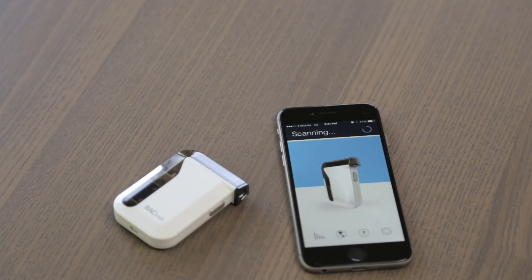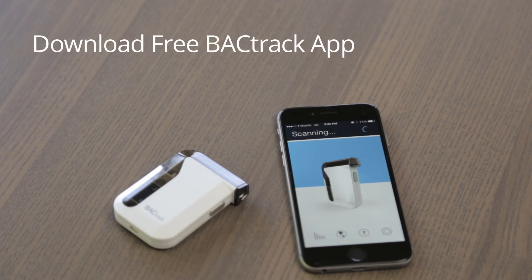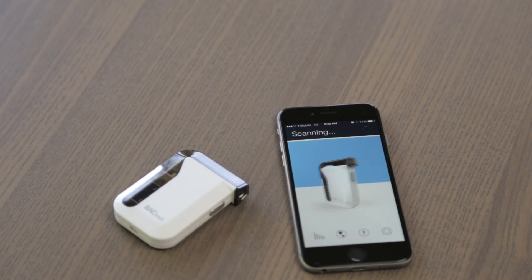BACtrack Mobile is extremely easy to use. Here's a quick overview of how it works. First, you need to download the BACtrack app from either iTunes or Google Play. Second, you need to make sure Bluetooth is enabled on your device. Once you've taken care of those two things, you're seconds away from testing your BAC.